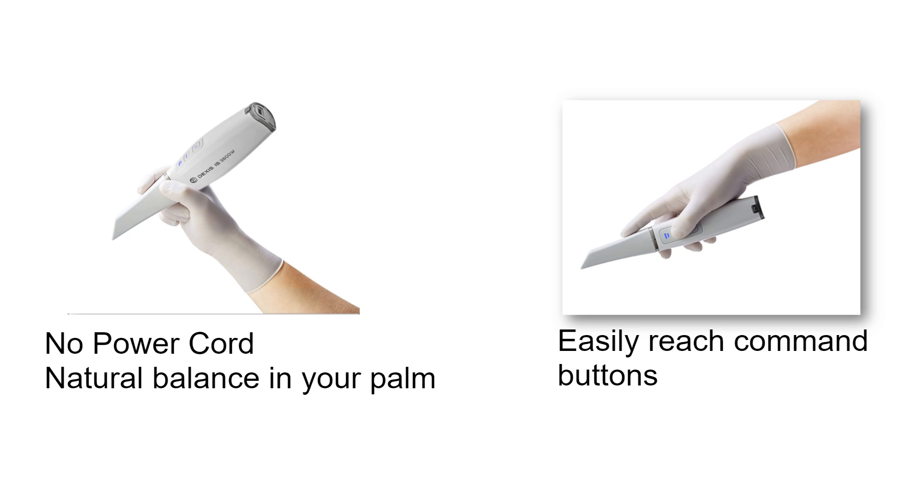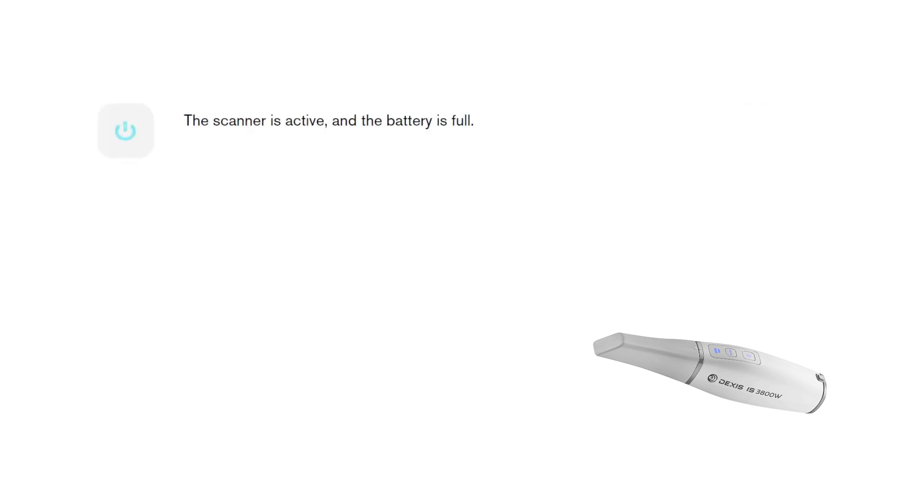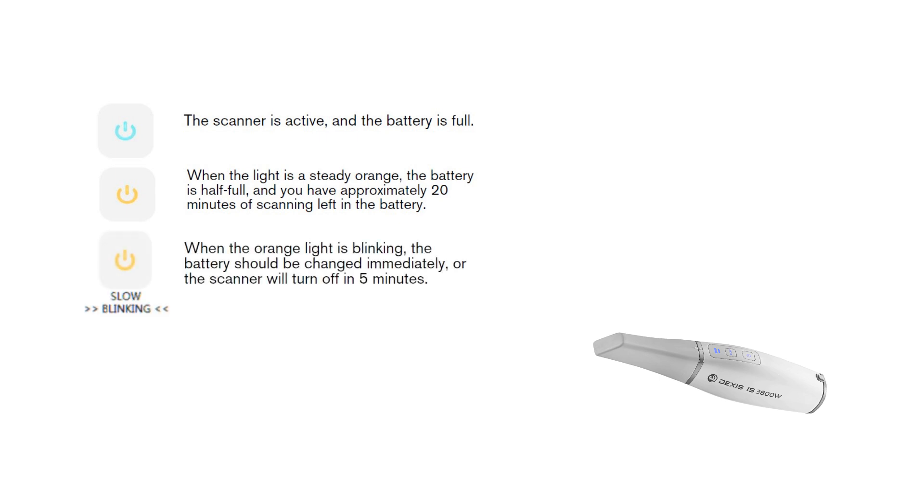The scanner design is well balanced and provides the user with a comfortable scanning experience. Press the power button for 3 seconds to power on and 3 seconds to power off. The power indicator LED shows when the scanner is active and the battery is full. When the light is a steady orange, the battery is half full and you have approximately 20 minutes of scanning left. When the orange light is blinking, the battery should be changed immediately or the scanner will turn off in 5 minutes.